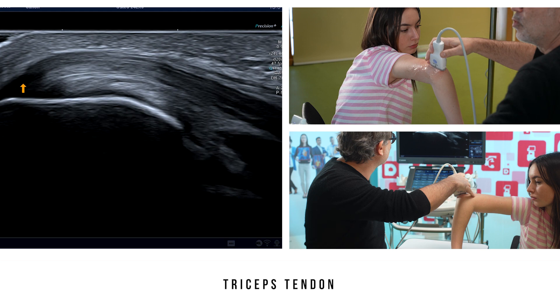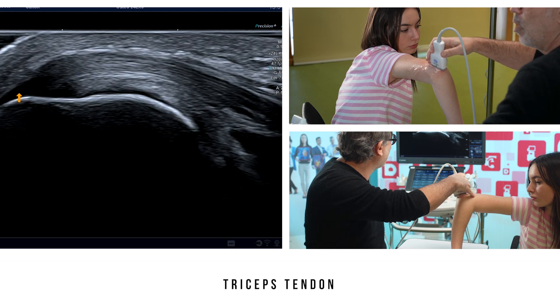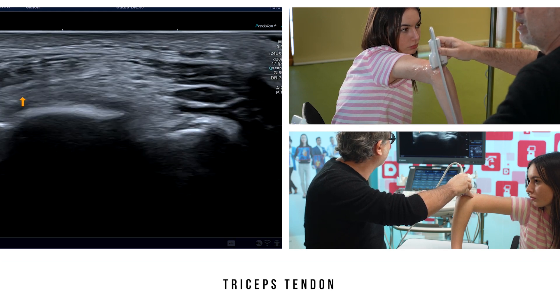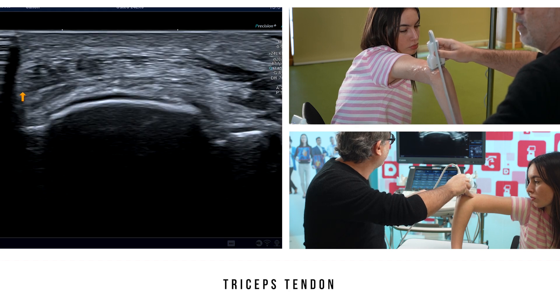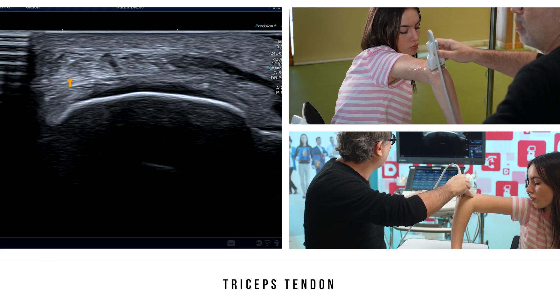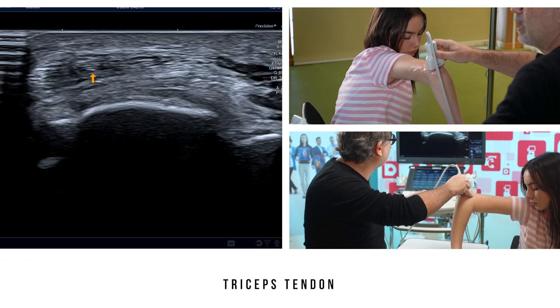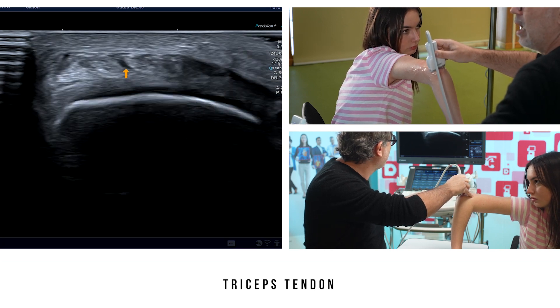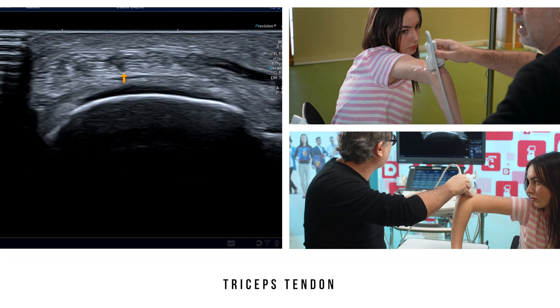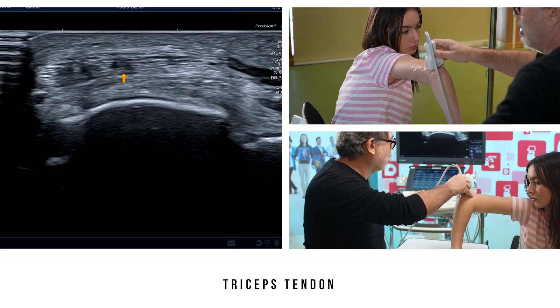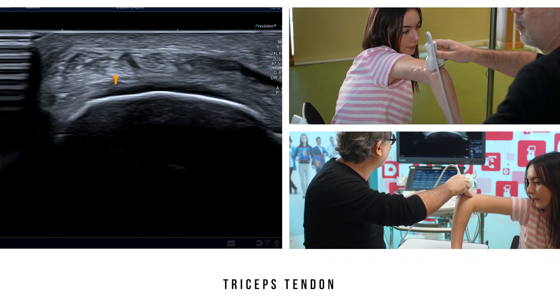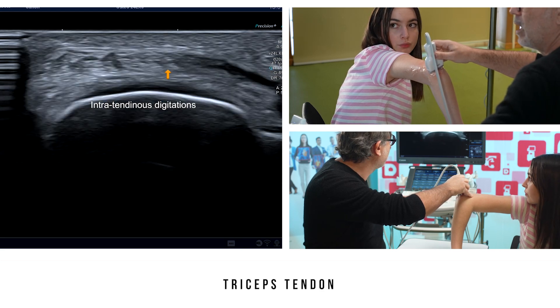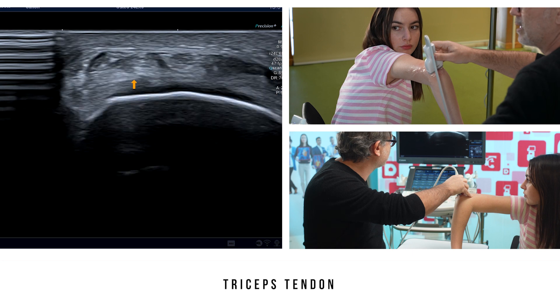If we look at the insertion of this tendon on an axial section by turning the probe 90 degrees, we can see that this distal insertion of the triceps tendon has a subtle fascicle appearance. But don't mistake these intra-tendinous digitations for potential partial tendon tears.